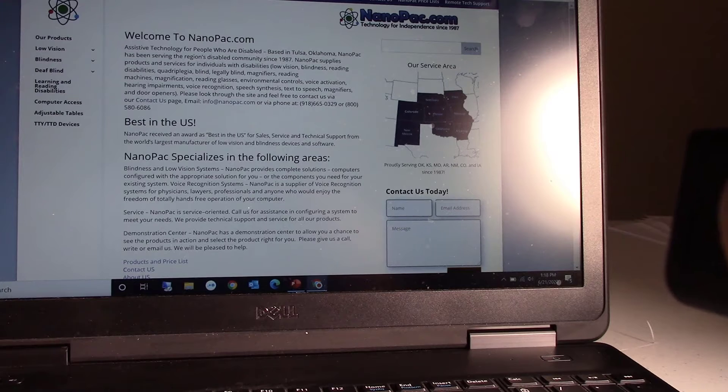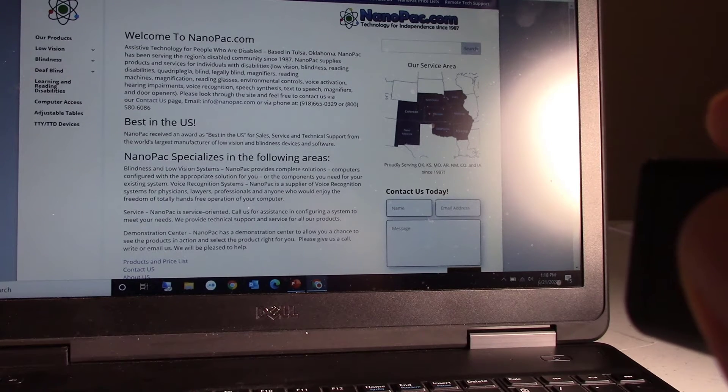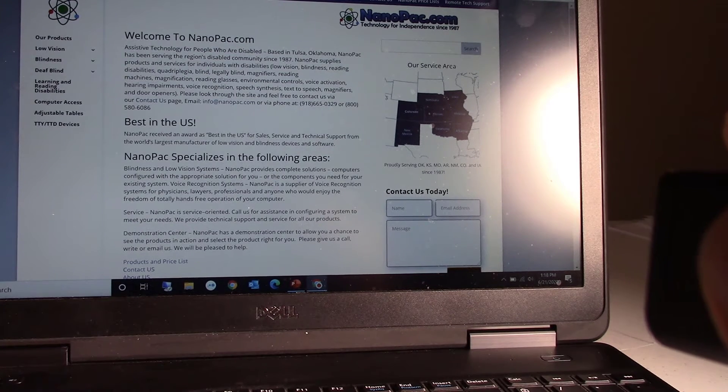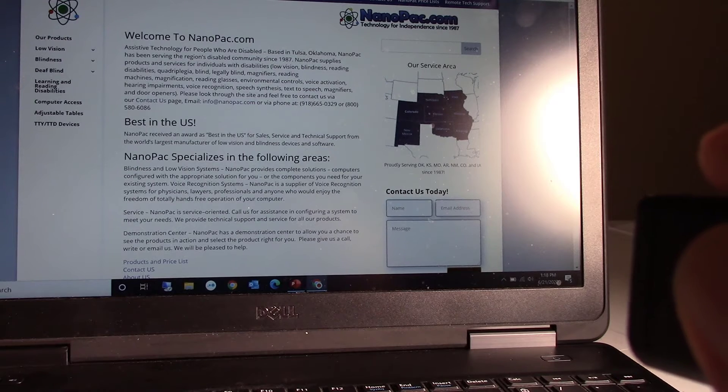If you didn't catch something, go back. The device reads: 'NanoPak supplies products. NanoPak has been serving the region's disabled community since 1987.' That is so cool. Press the trigger button to stop it. Maybe I want to read right here — 'NanoPak specializes in the following areas. Blindness and low vision systems. NanoPak provides complete solutions — computers configured with the appropriate solution for you, or the components you need for your existing system. Voice recognition systems.'